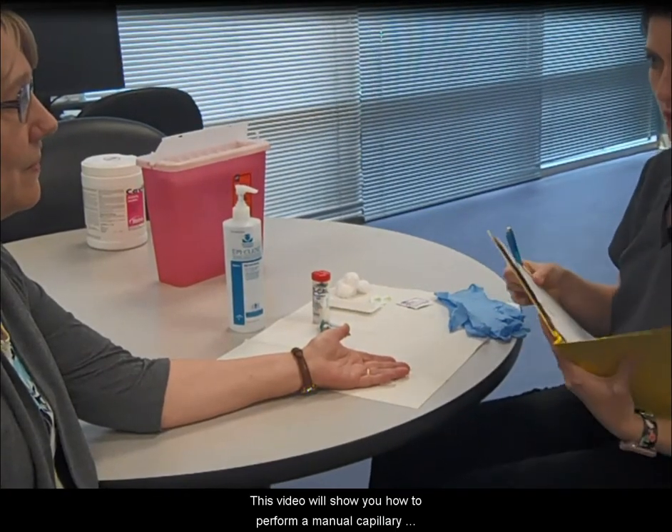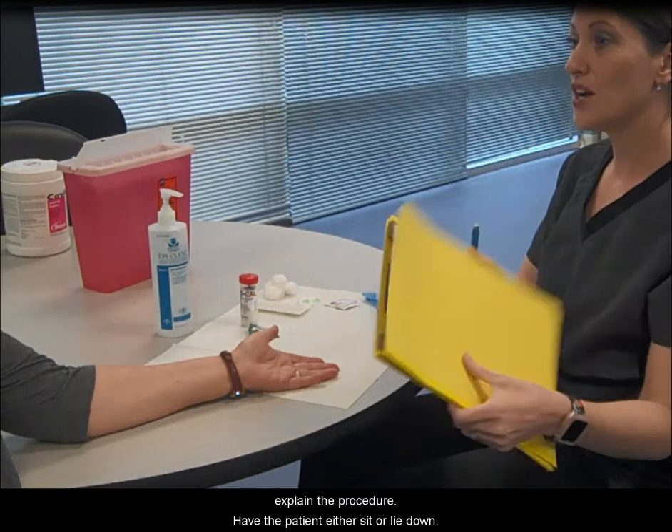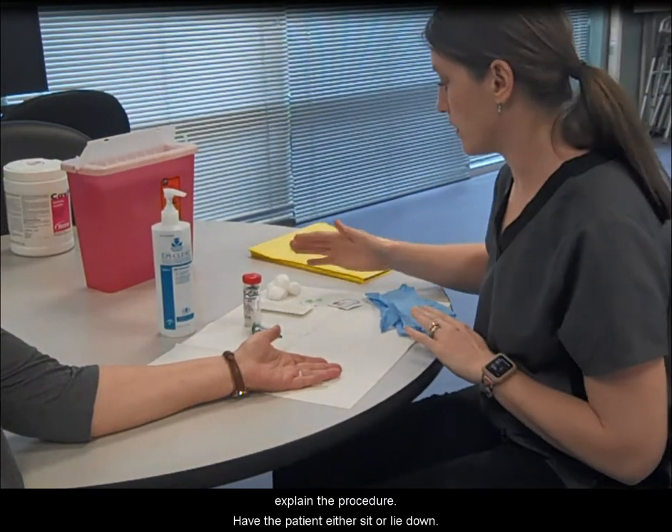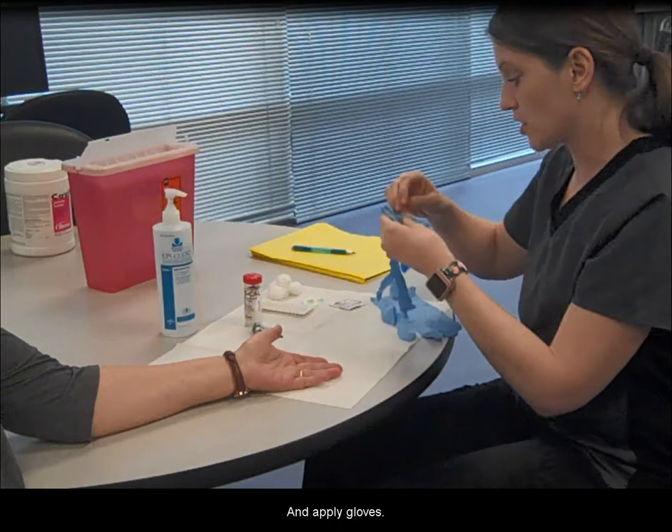This video will show you how to perform a manual capillary puncture. Identify the patient and explain the procedure. Have the patient either sit or lie down. Perform hand hygiene and apply gloves.